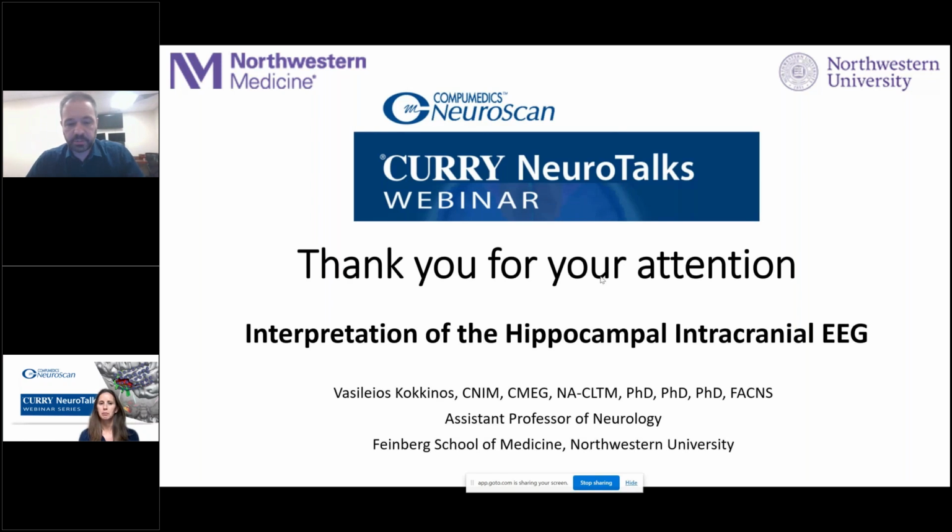This is really not the topic of this talk. This talk was focused on the normal elements of how to appreciate the background before going into the ictal elements. The importance of understanding these background and foreground elements is that a really abnormal area will have an abnormal background.